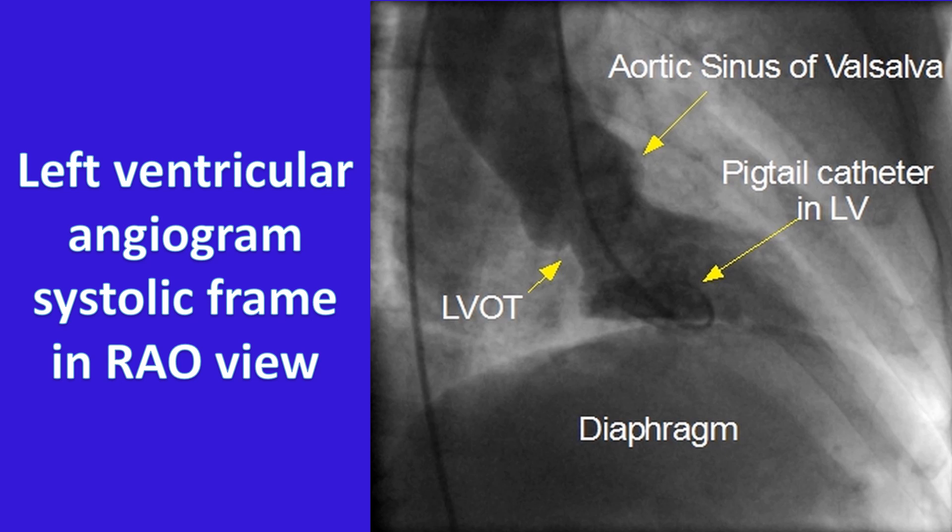As there are multiple holes in different directions, the recoil force on the pigtail catheter is cancelled out, and the chance of a single jet producing myocardial staining is reduced.